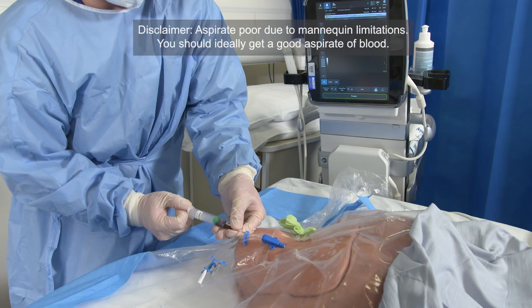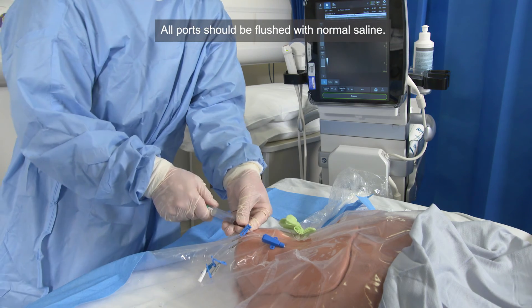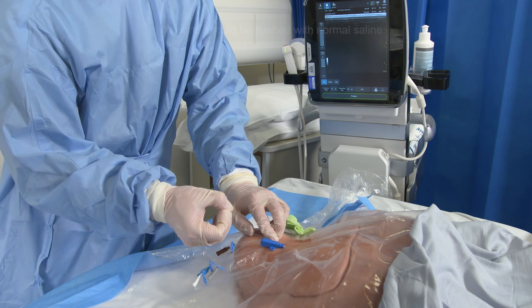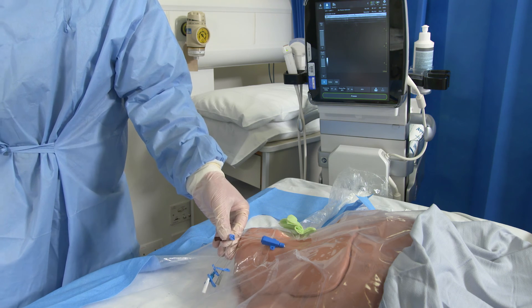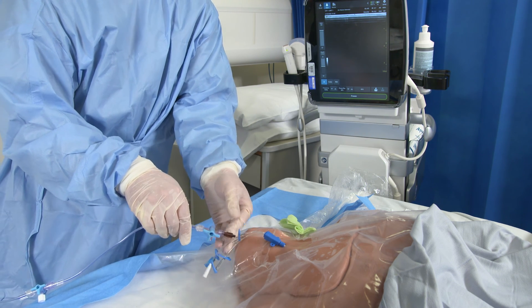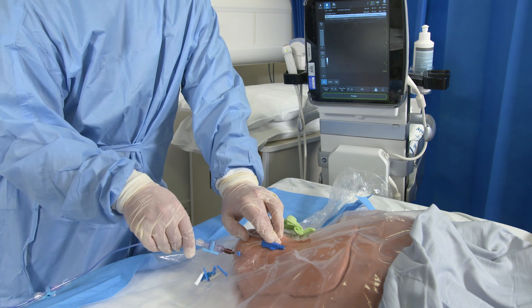Check that you're in the right place by aspirating through the lumen, and then flush all the lumens with normal saline. You can use one or two sutures and a sterile dressing to keep the line in position. You can also attach the transducer in order to monitor venous pressure. Once your line is in place, get a chest X-ray in order to confirm position.